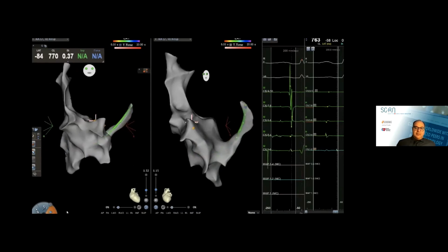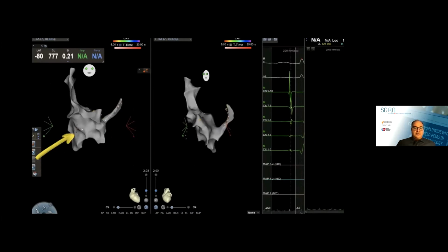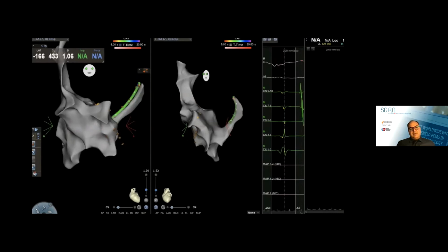So now I have all the structures that I need to have. We'll leave the image in RAO, LAO, so as if you're looking at the fluoroscopy, essentially. Now we push the quad catheter up there. Again, these are non-nav catheters, so you don't see the full length of the catheter, but you see the electrodes on them if you created an adequate matrix. So you have to create some matrix in the ventricle. So that goes into the ventricle. So that's the RV catheter.